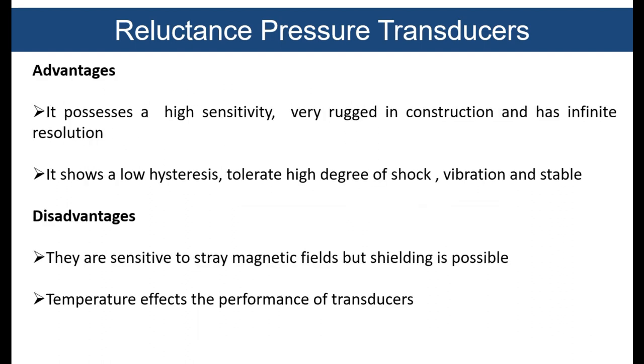The advantages of having this reluctance pressure transducer are that it possesses a very high sensitivity, is very rugged in construction, and has infinite resolution. It shows low hysteresis. It tolerates a high degree of shock and vibration, and it's very stable.